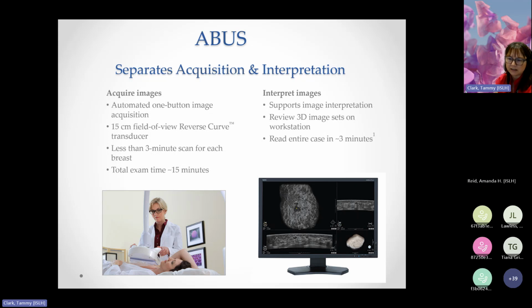So here you can see the sonographer or the mammographer, whoever is performing this exam. It's a 15 centimeter field of view reverse curve transducer, and they say it takes less than a 3-minute scan for each breast with a total exam time of 15 minutes. I do think it might take a bit longer than that once you get really experienced, but I think that probably is a reasonable time frame.